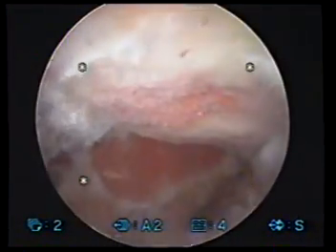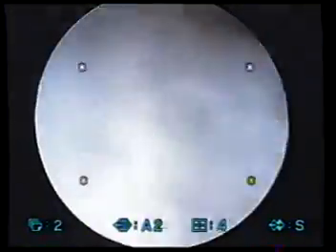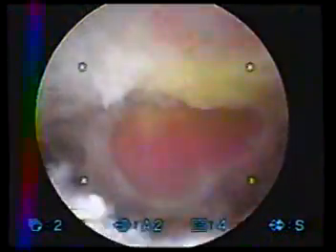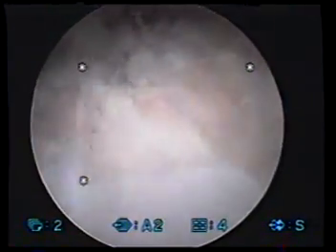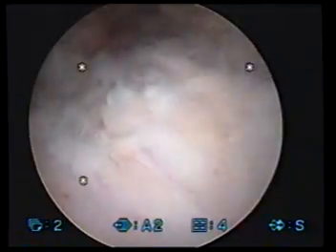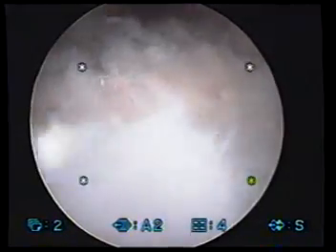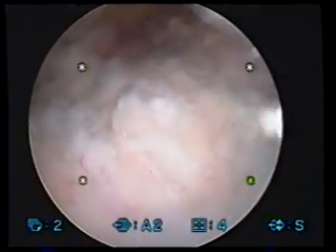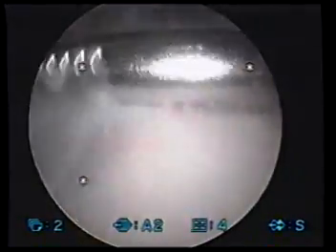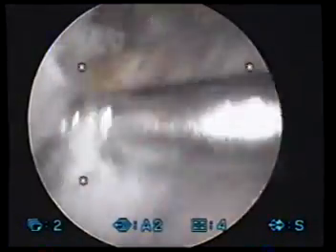Looks like we need to do a little bit more smoothing there. Here's your rotator cuff — here's what we're going to need to work on next. There's the flat undersurface of the acromion and there's the collarbone joint. Now this is your rotator cuff right here, what we're going to be working on next. What we see is rotator cuff tissue wear, and right on top of it is this big, thick, swollen bursa. So what we do is we use this little shaving device — we remove the thick, swollen bursa so we can see the rotator cuff underneath.